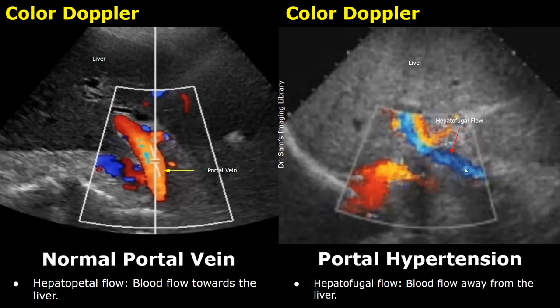This can lead to portal hypertension. In this image there is hepatofugal flow, which means blood is flowing away from the liver. The color is blue, which indicates that the blood is flowing away from the probe. There is also some color mixing due to turbulence.